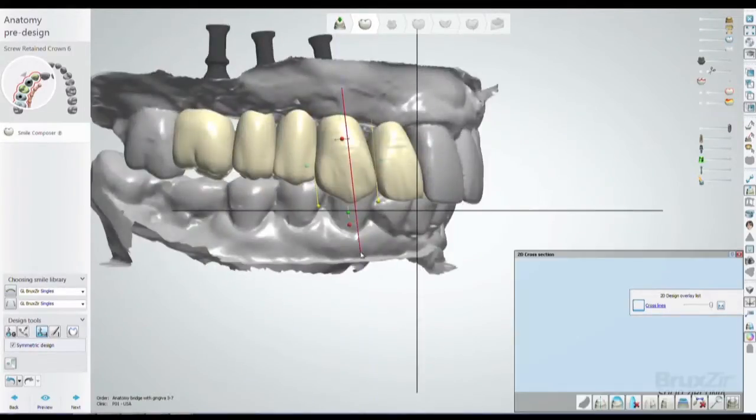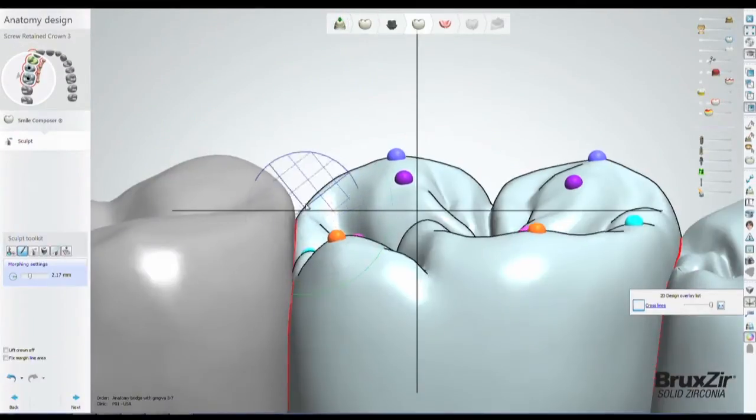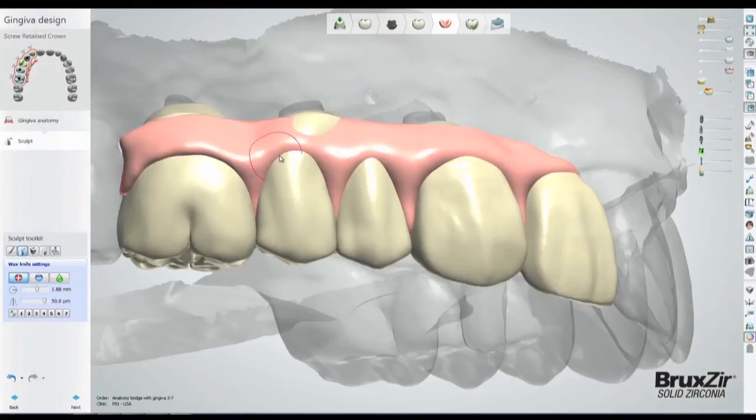Then the prosthetic design is digitally fine-tuned, including occlusal contacts, incisal edges, and gingival margins.